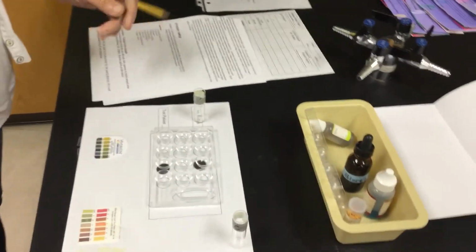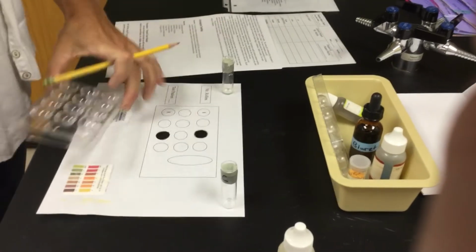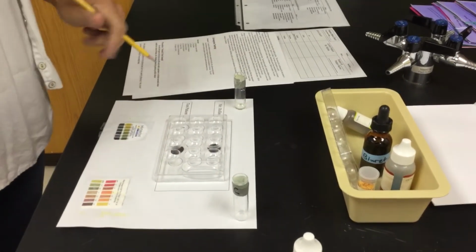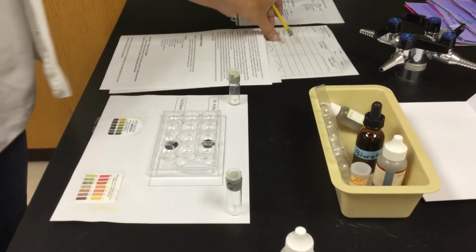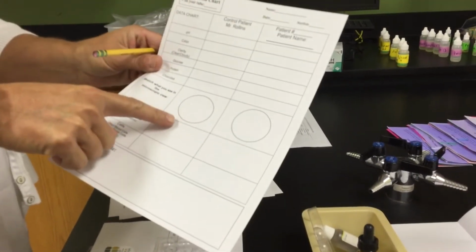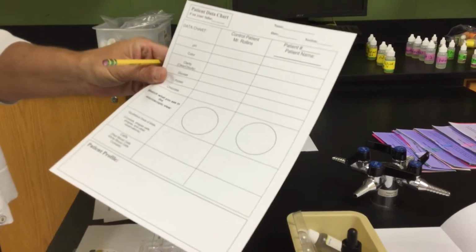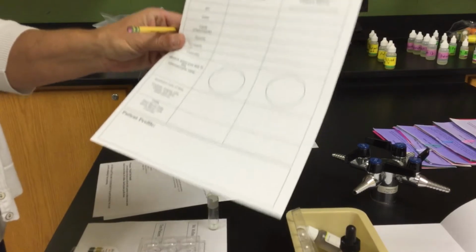So a little setup that you have: we have these little glass tubes, we have our little chem plates that you see here, and they are on our paper underneath that is kind of blackened in. We'll talk about that in a moment. And we have some pH stuff along the bottom. You have a data chart that you will be opening up. So we're going to run through the control patient first. Tomorrow you will see your actual patient, and you will get a little scenario on him as well. So this should be on your Google Classroom page also.